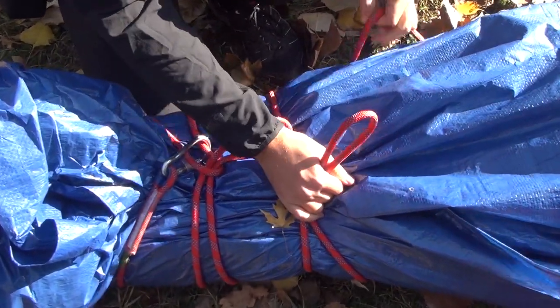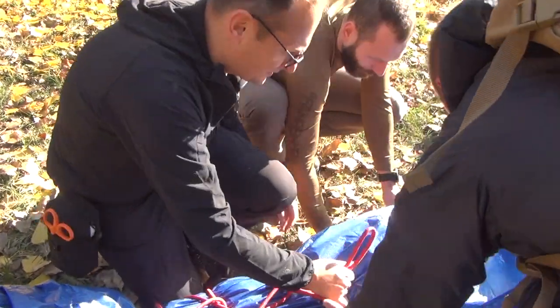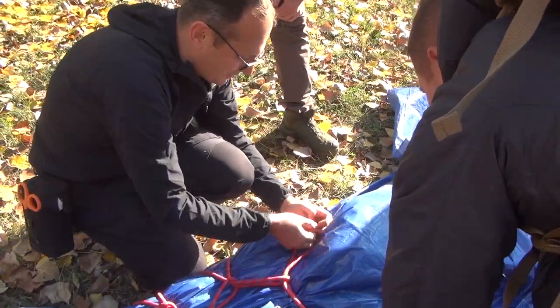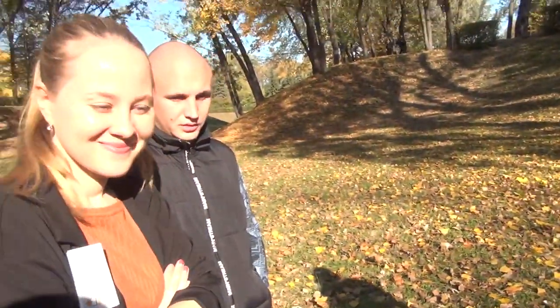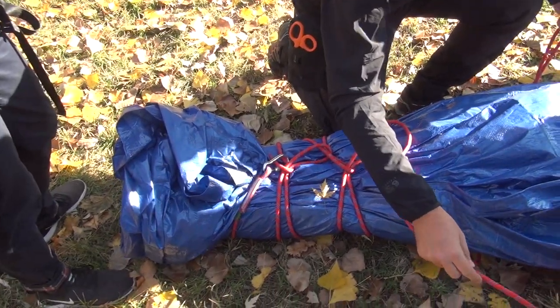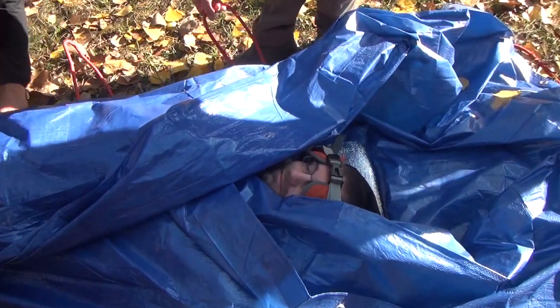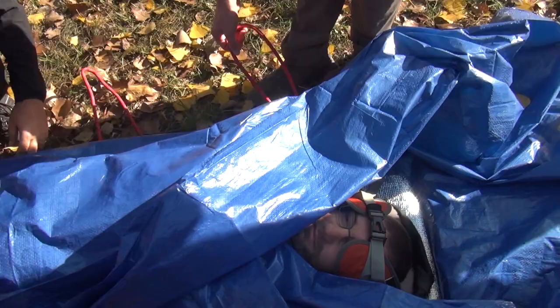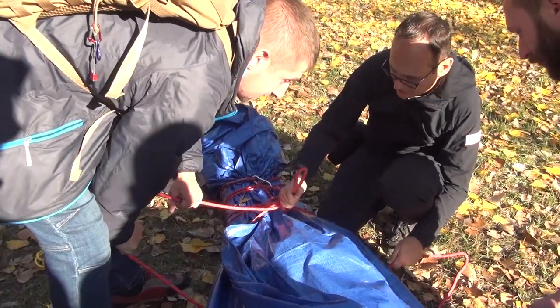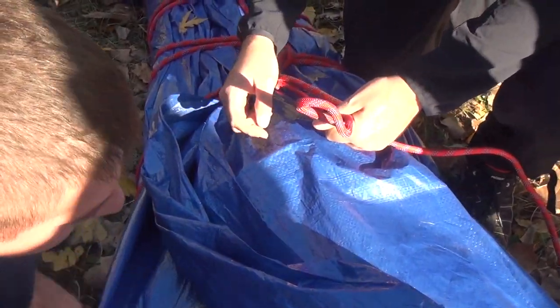Sometimes you have to readjust a bit. And you just keep on going. Okay, we have to make a little bit more. It will be fine. Yeah, it happens. Is it now going back or no? Wait, where is this going? Something went wrong. No, this was right. We should use this loop. Where is this loop going here? Pull this one there. Okay, this one goes here. And then let me see where this one goes. Like this. Now we have got enough. Try to put it back there. It should come back.